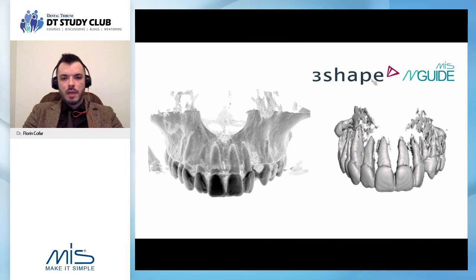So in order to get the same that we're getting in analog, meaning the surgical alveolar model, we can get the DICOM of the patient, and with the software for MIS you can basically extract the roots. Let me explain some basics here. The DICOM is made of voxels, it's a cloud. STL is a solid object. But if you just change the settings, you can make most of the bone go away, and then you can export to an STL format to get the root shapes.